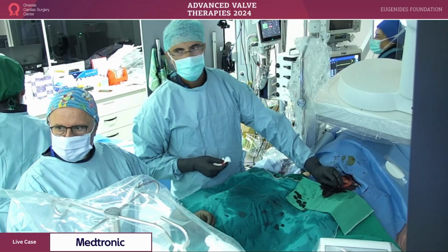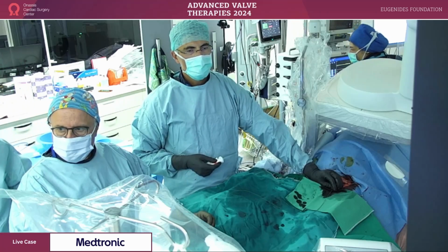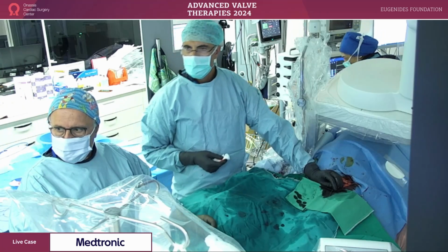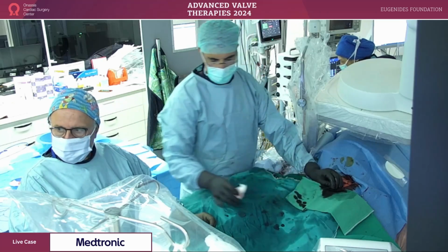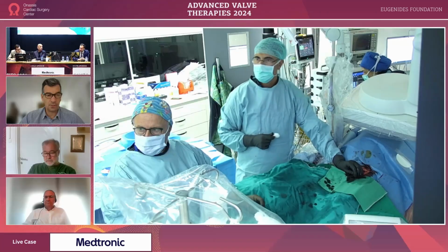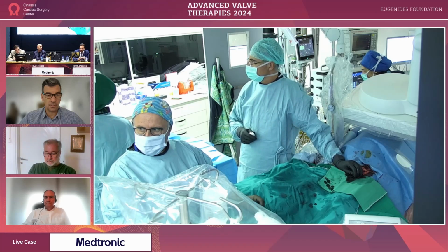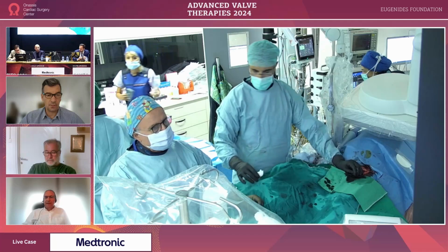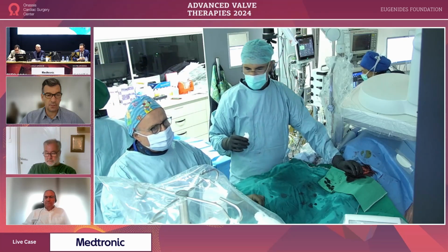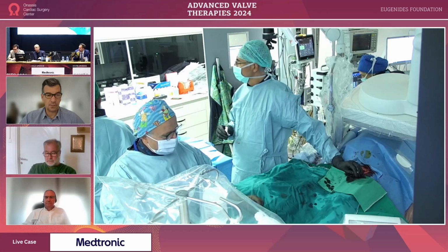Okay. Well, let me ask Dr. Spilias, University of Miami, do you do routine femoral ultrasound access? Yes, we use ultrasound and fluoroscopy at the same time to mark the exact height of puncture based on the femoral head. And we also use ultrasound to ensure that the puncture is central.